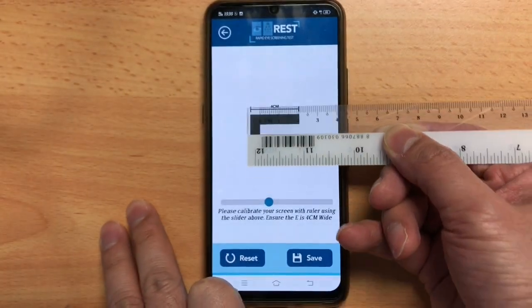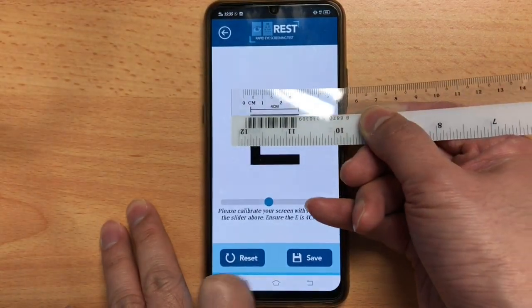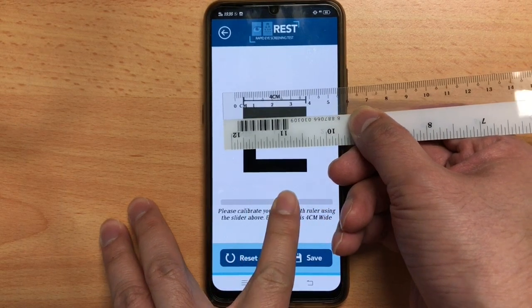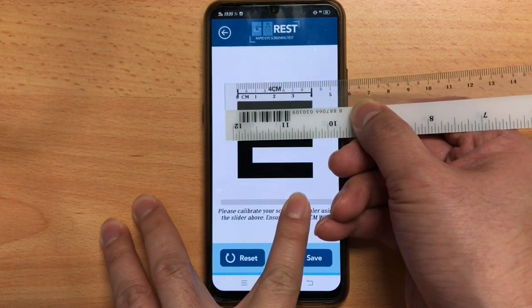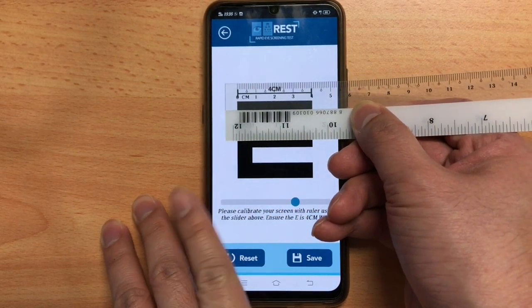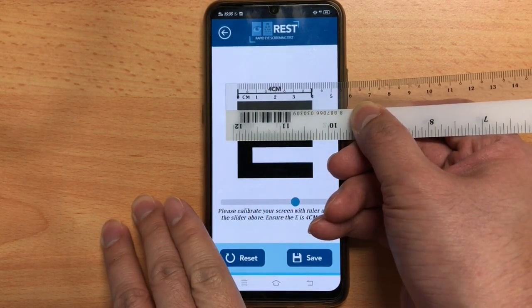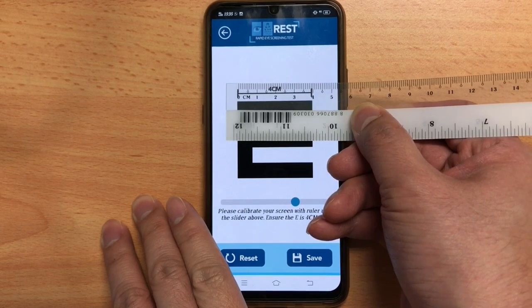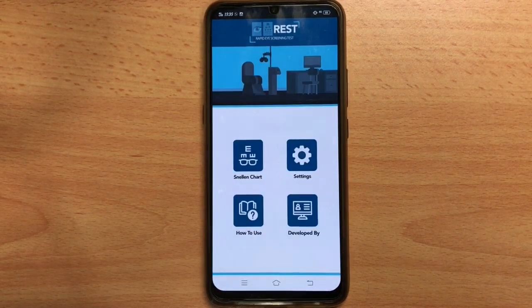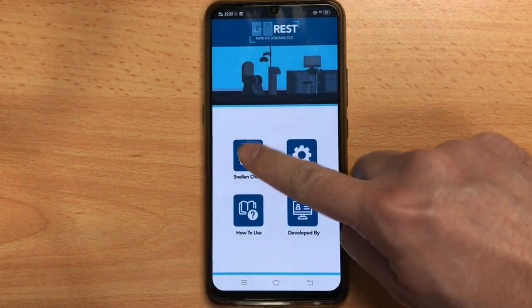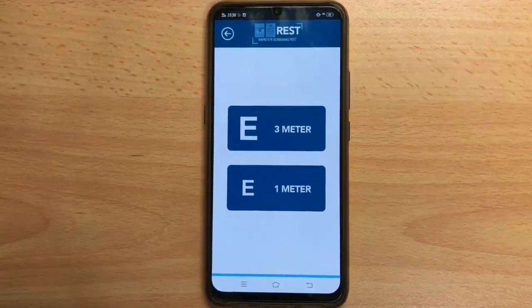The calibration is needed because there are several sizes of phones in the market today. This is to make sure that the character used is standardized to the gold standard chart that we use, to retain its accuracy.